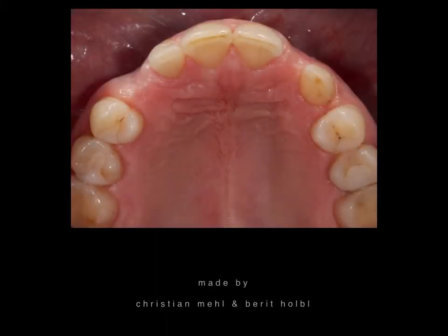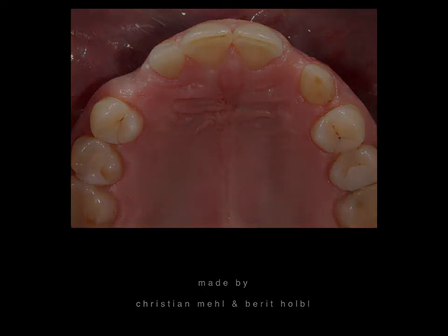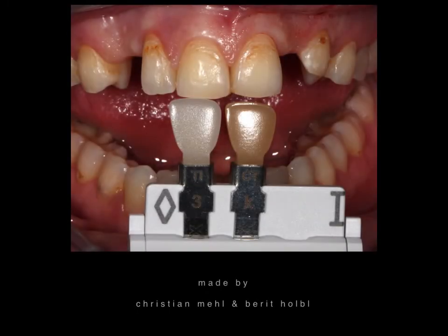This is a view from the palatal side, from on top. You can see it's not an easy situation to restore, as we have different sizes of gaps, very colorful teeth, and a deciduous tooth on the other side — not an easy situation.